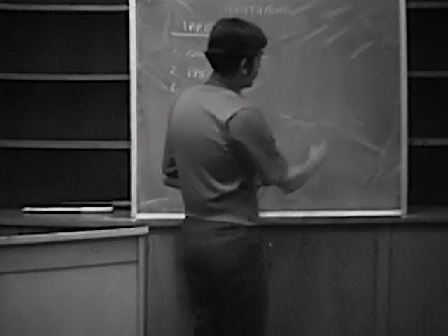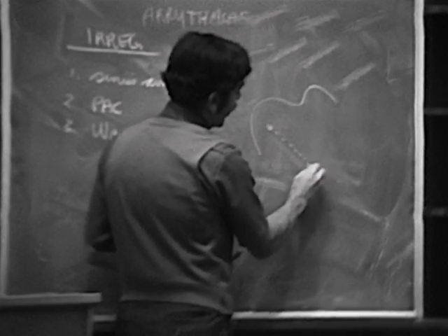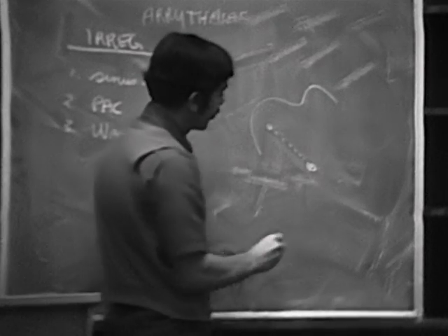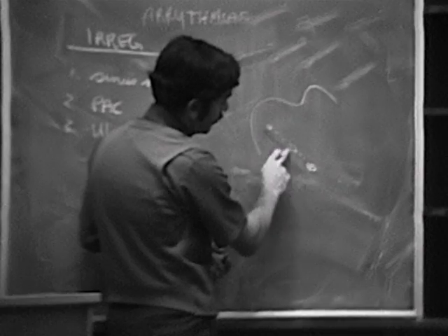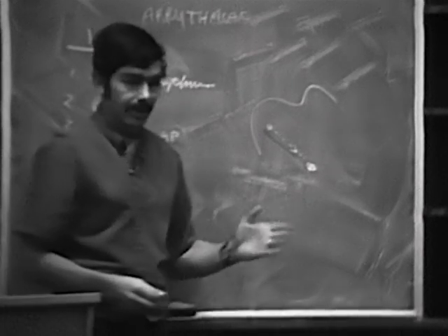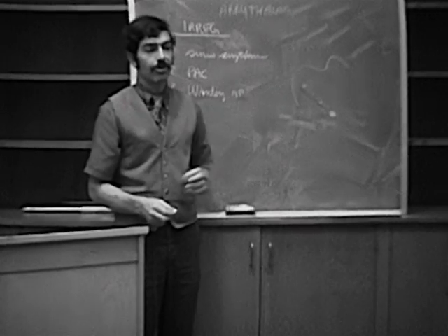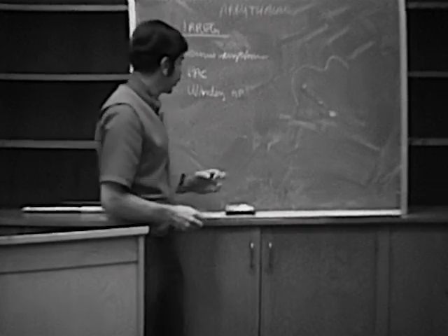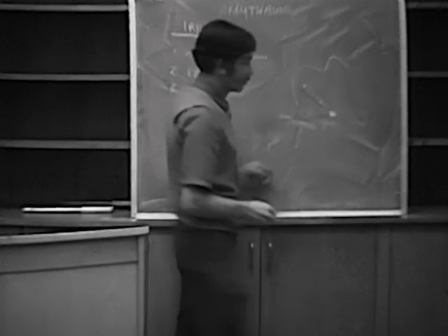And they say that you have a band of conducting tissue in your atrium that goes down to the AV node. What they say wandering atrial pacemaker is that the pacemaker wanders down towards the AV node, and sometimes actually can go into the AV node. So you wind up temporarily with a few beats with a nodal rhythm, and then it goes back into a normal sinus rhythm again. But generally, it's just somewhat increased in the spectrum of irritability.